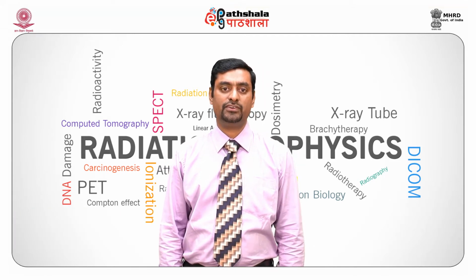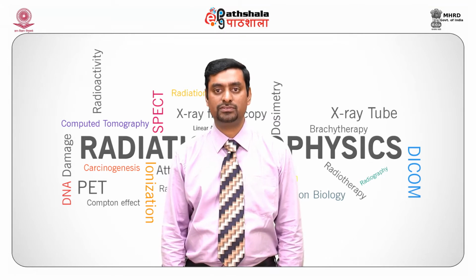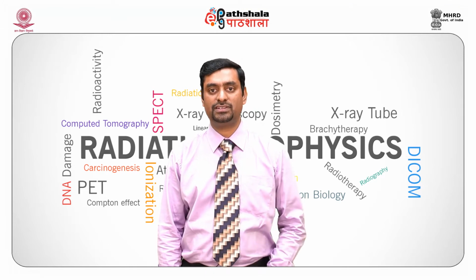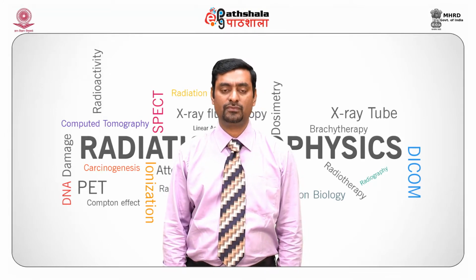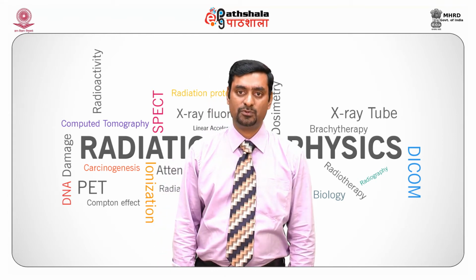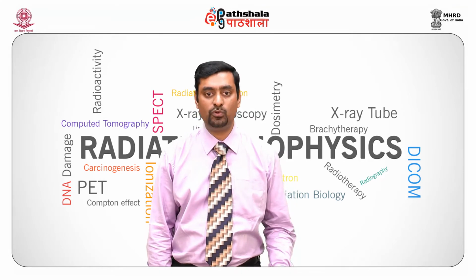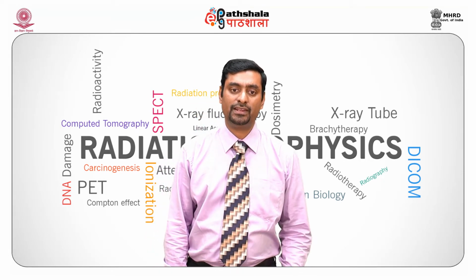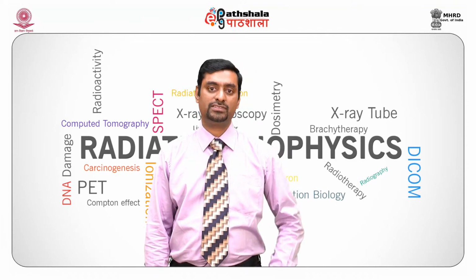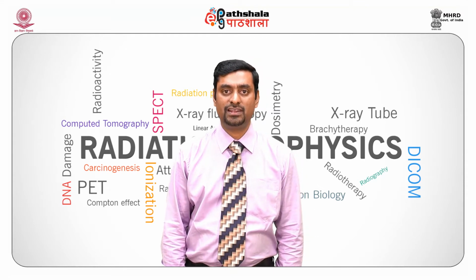Next, we move on to the X-ray tube. It requires high tube loading for extended use because fluoroscopy is a continuous process. It's not like the exposures which are taken in routine radiography. It can have a grid controlled X-ray tube for instant switching between exposures. It may have about 3 focal spots for improved image resolution. It can have fixed fluoroscopic machines with a rotating anode X-ray tube, but mostly the small C-arm machines have a stationary anode X-ray tube.